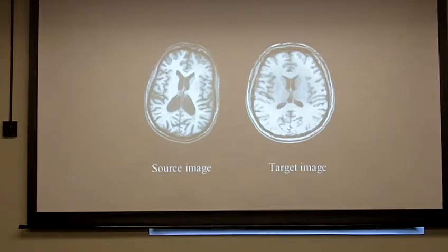Yeah, so I see no problem doing affine transformation in other software, SPM or FSL, Flirt, and then taking that image to ants and doing the nonlinear warping there. Olu will talk about the specifics of how to implement the whole registration process. I'll talk about more conceptual issues in registration.